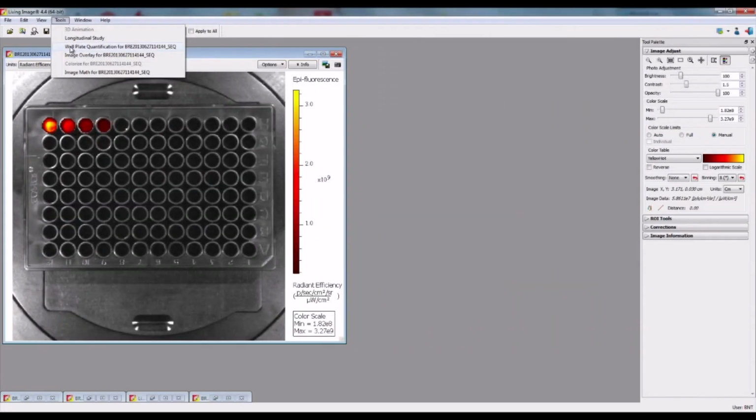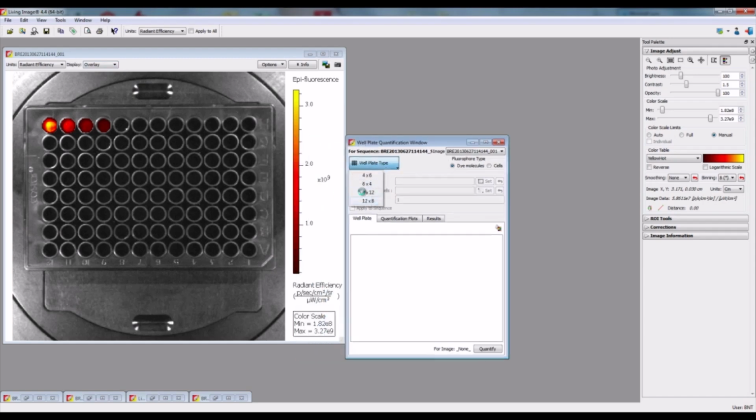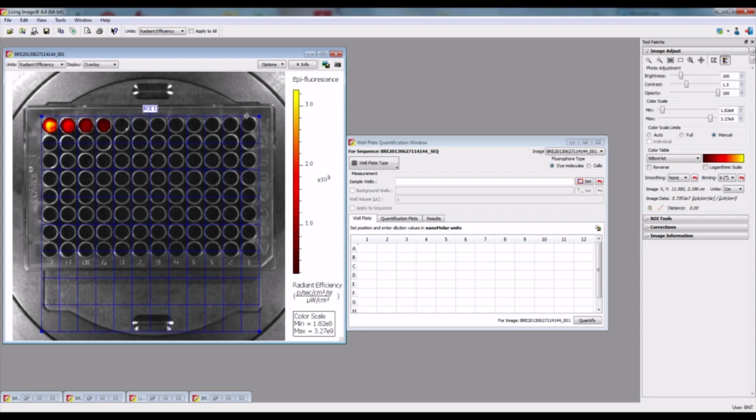The process for creating a fluorescent quantification database is similar to the process for creating a cell count quantification database. Instead of cell number, you will enter the nanomolar concentration and volume per well. In our example, we started with 100 microliters of a 20 micromolar solution. A 1:2 dilution series was performed in a black well plate.